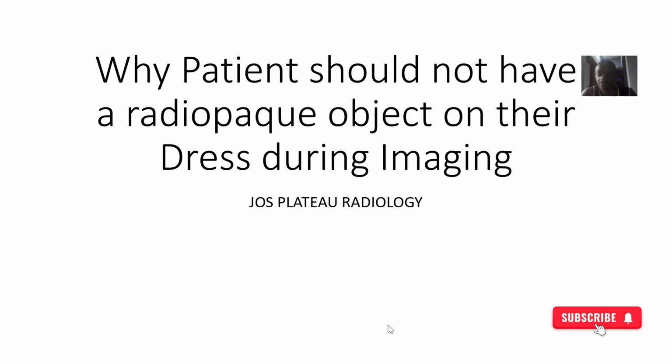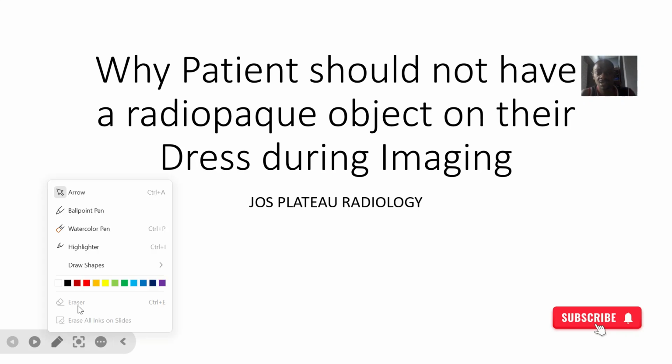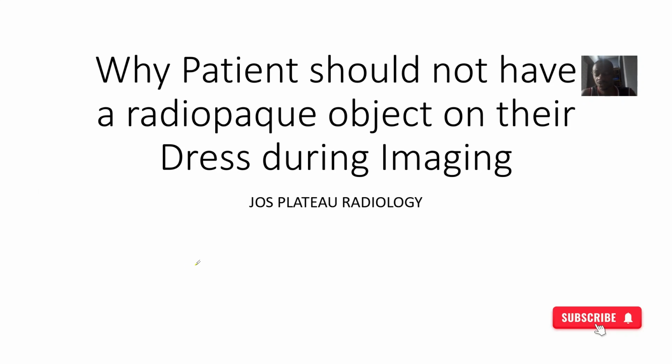Now I want to look at a very strong instruction in the radiology lab, and also give reasons why this instruction is there. This instruction is that patients should not have a radio opaque object on their dress when they are imaging. So I want to now look at what a radio opaque object is, and of course why this rule is set in place.